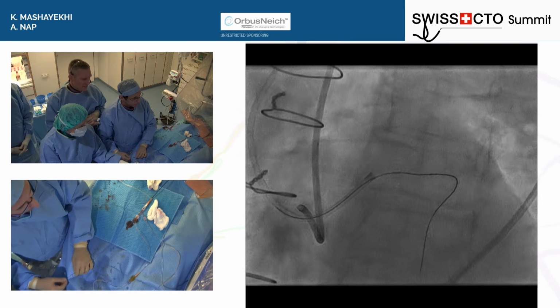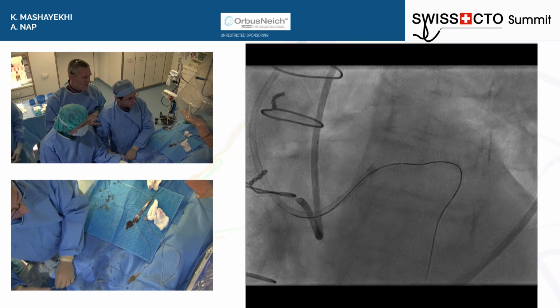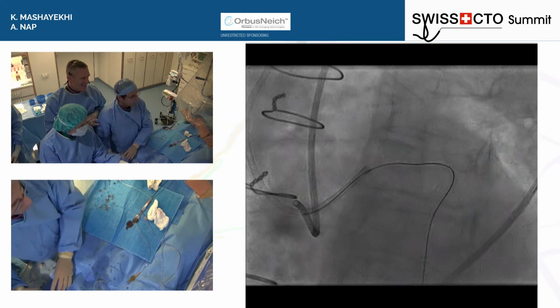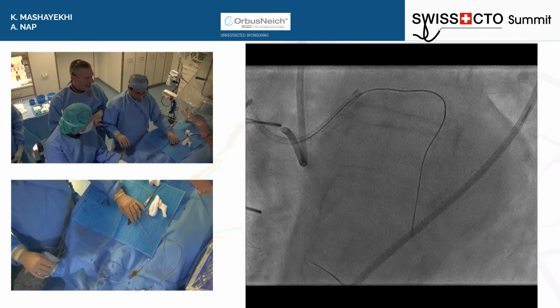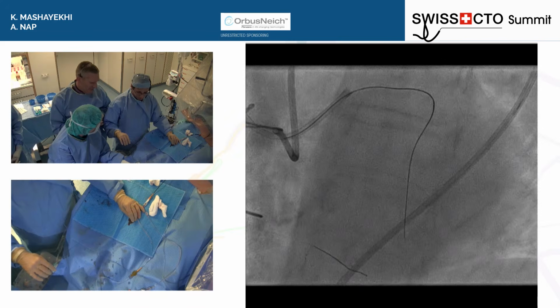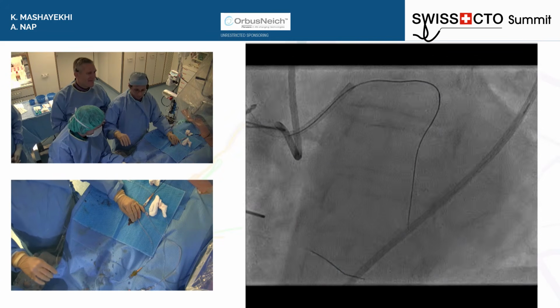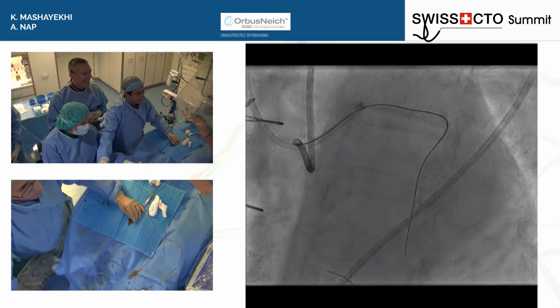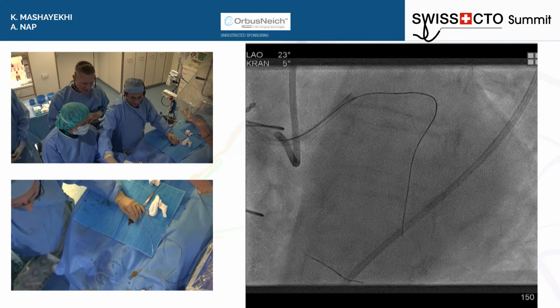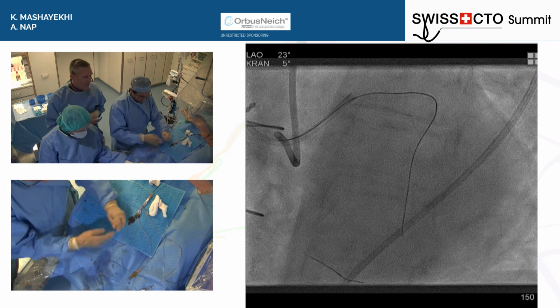Some bad tongues are saying that it went by mistake, but it's not a mistake. Okay, trap. This means re-entry on the way back. Sometimes it happens. Well, at least it's in. At least it happened. Okay, now the Sapphire.